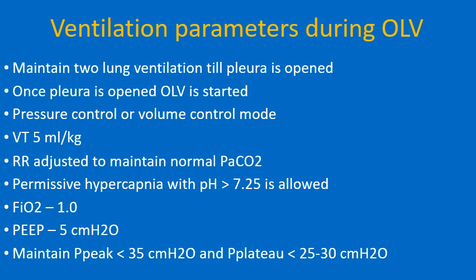PEEP of 5 centimeters of water we have to keep.